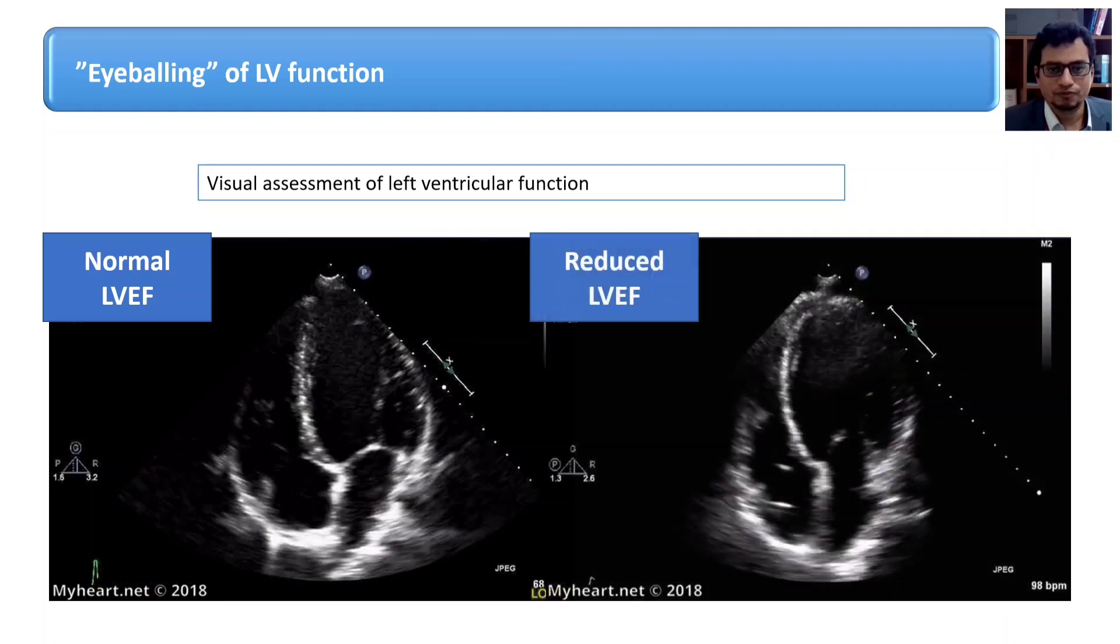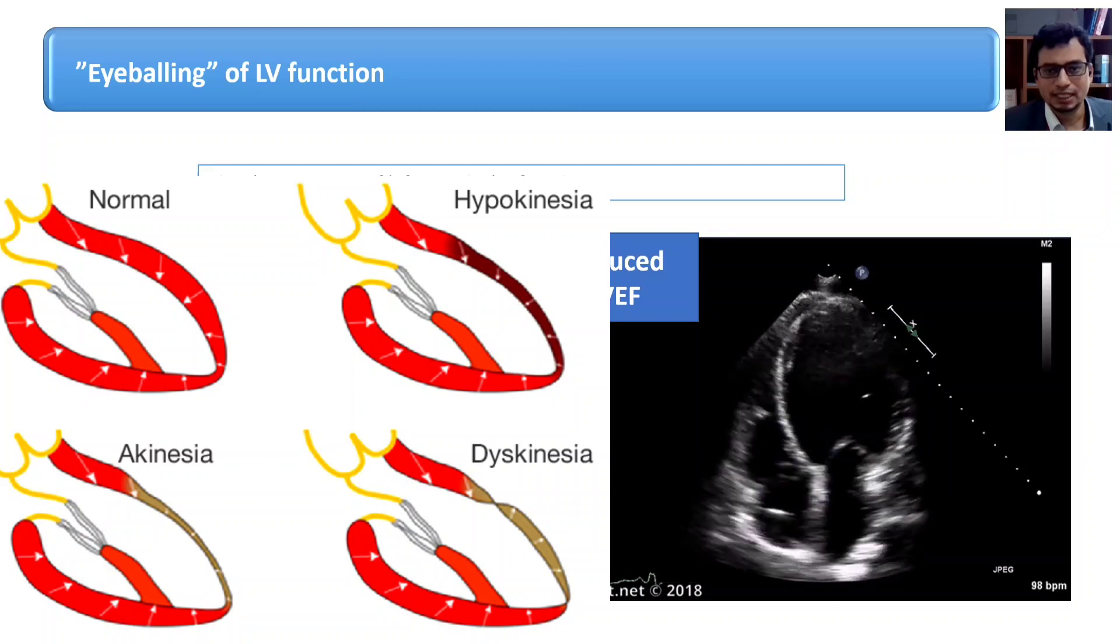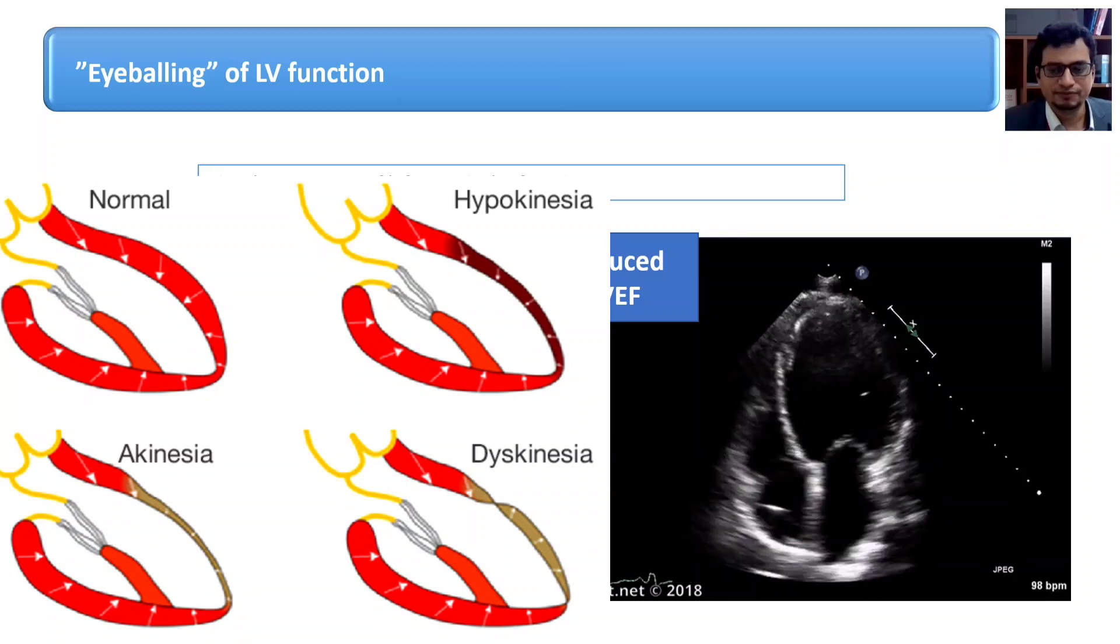Each segment should be assessed in multiple views. Follow the scoring system for the visual assessment of wall motion abnormalities: normal movement, hyperkinetic, hypokinetic, akinetic and dyskinetic. So there are five types of movement possible.